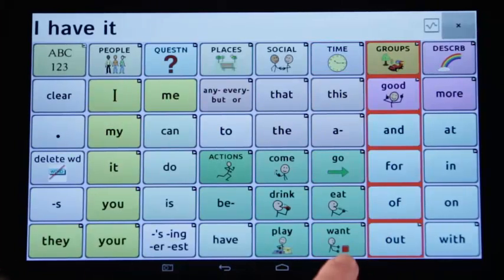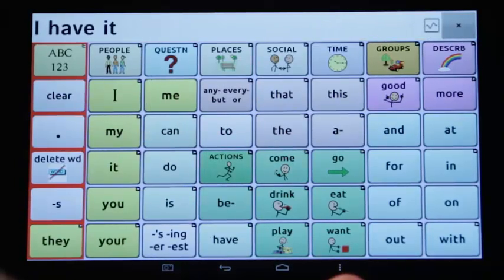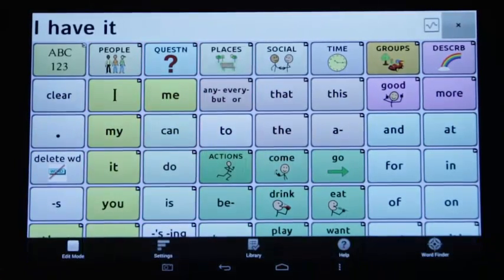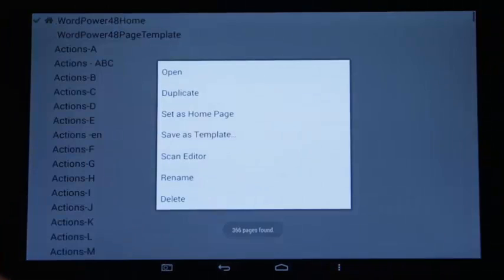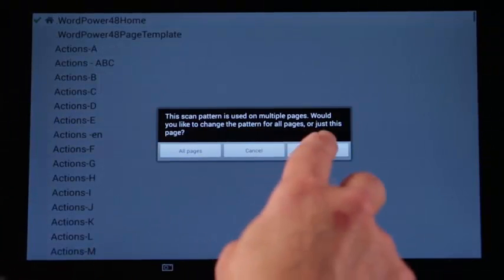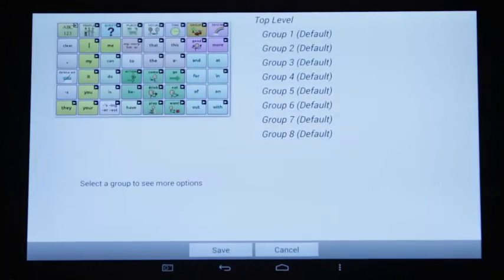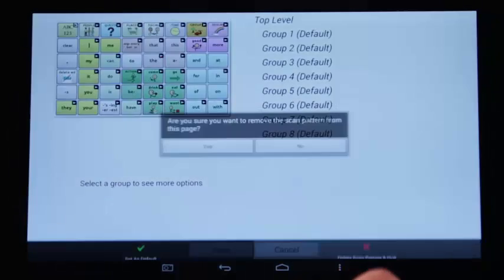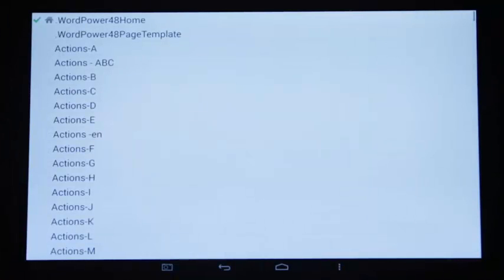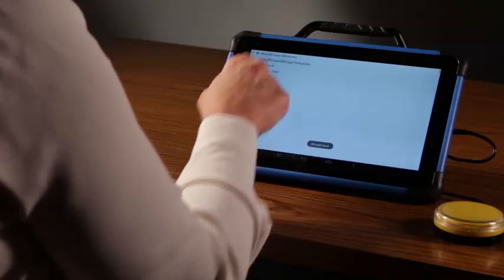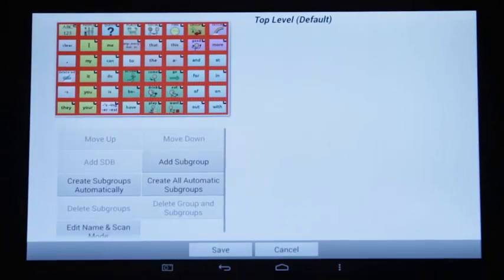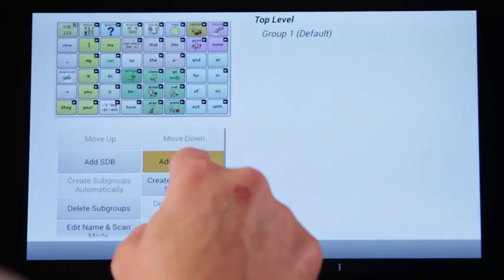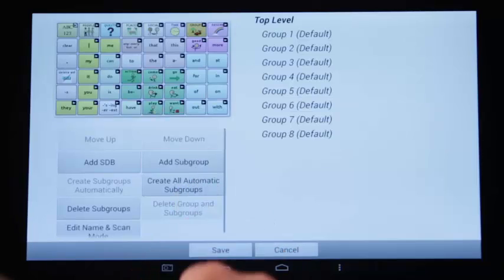I will go back in the file and delete the scan pattern to start over with the option to apply to all pages. Tap Menu, Edit Mode, Pages, tap WordPower home page and Scan Editor. Tap Menu, Delete Scan Pattern and Quit. Tap Yes. Now to set up to apply to all pages from the start, we can tap WordPower 48 home page, Scan Editor and All Pages. I will demonstrate the same pattern creation: Add Subgroup 8 times and then define them by column. Tap Save and try it out.